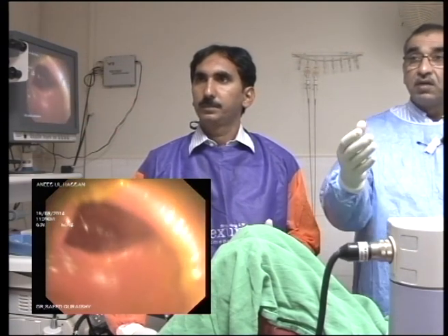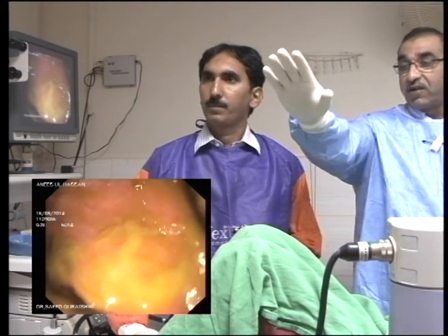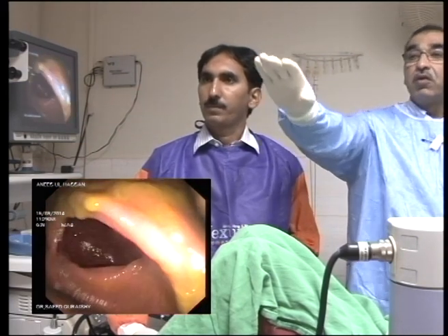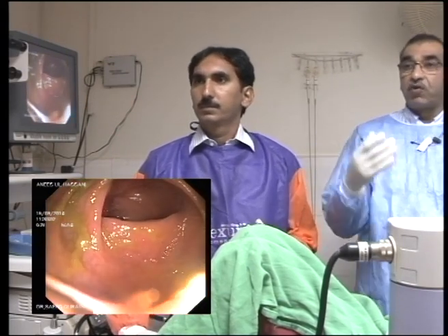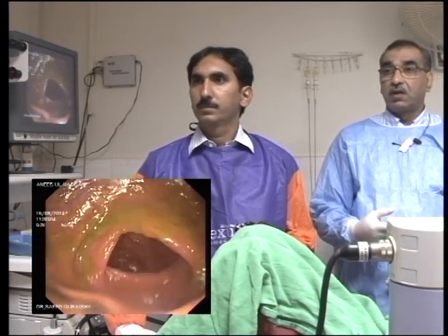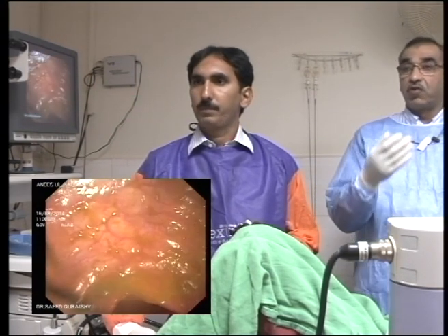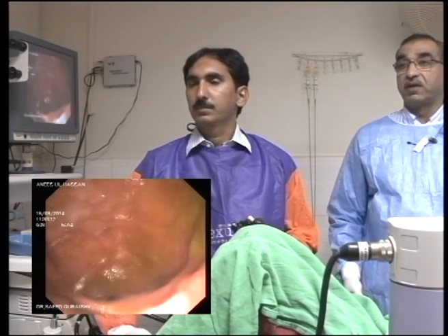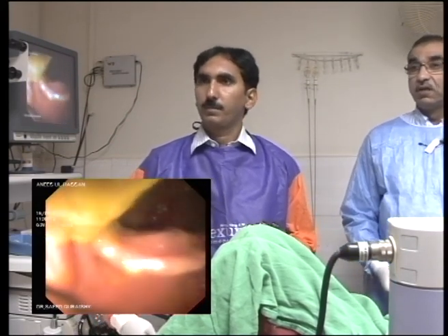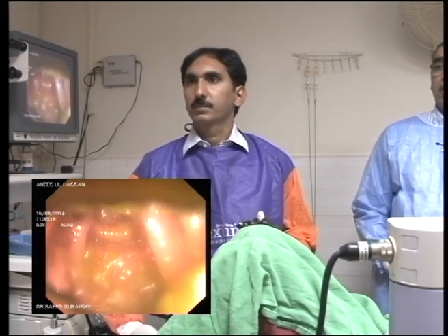That's good. Okay, look up, there, that's it, right? So you've checked that bit out. Now look away from it, that's fine. Now withdraw, look, yeah, look there, okay, look away from it, withdraw a bit more. Yeah, that's fine. Up now, you can look at it. That's fine. Good. That's good. Good. Good. Look across. Look down. Okay.